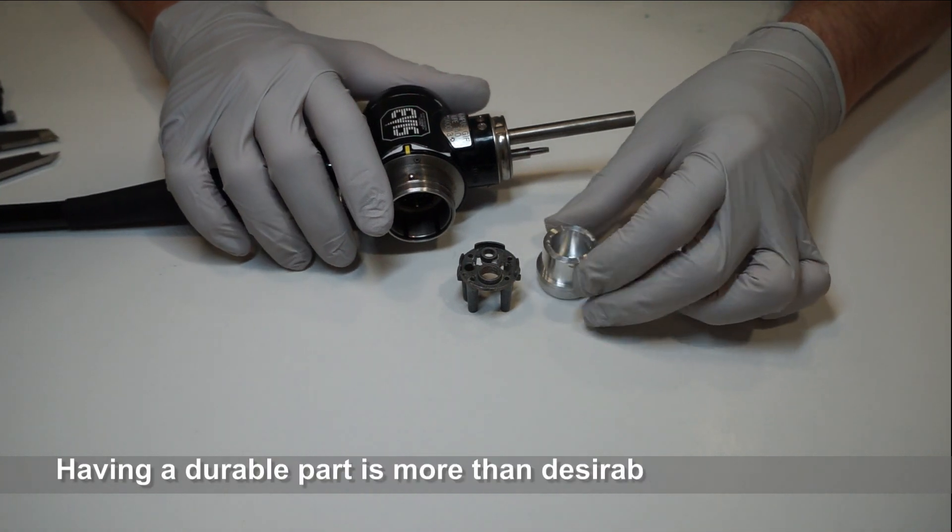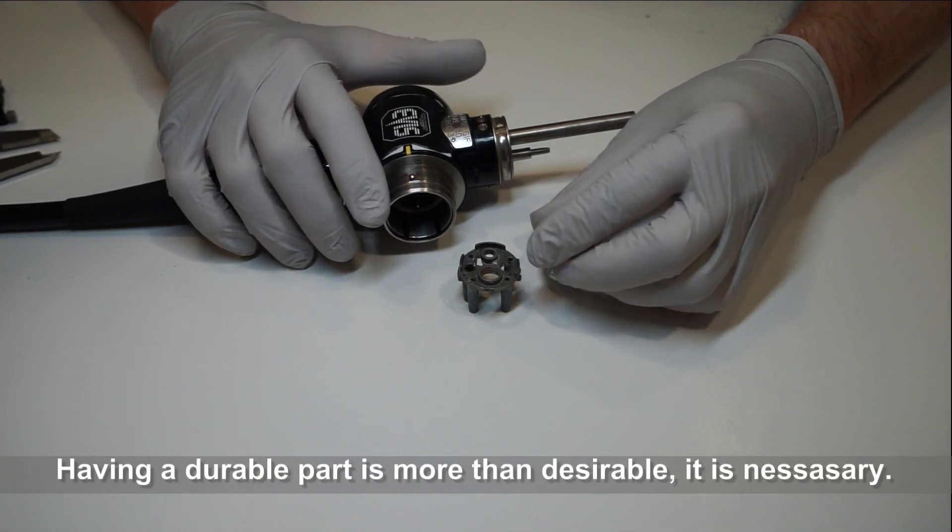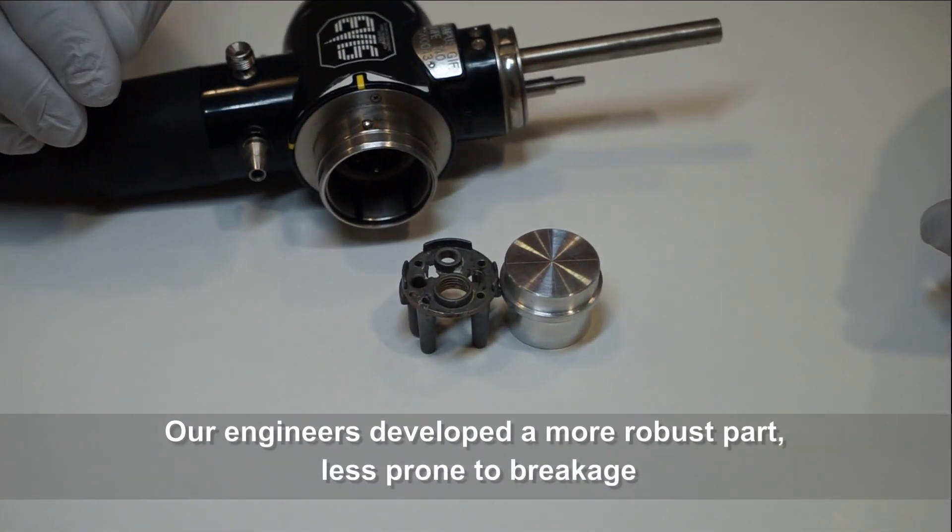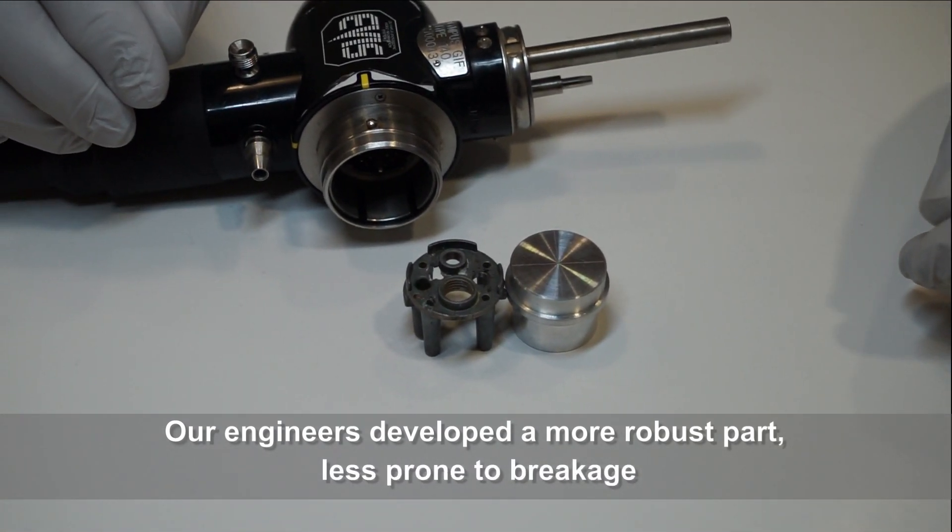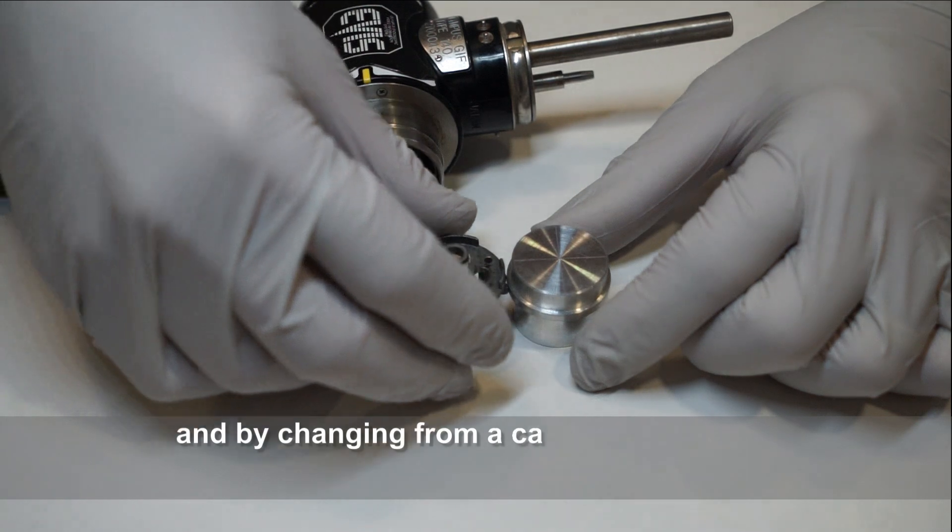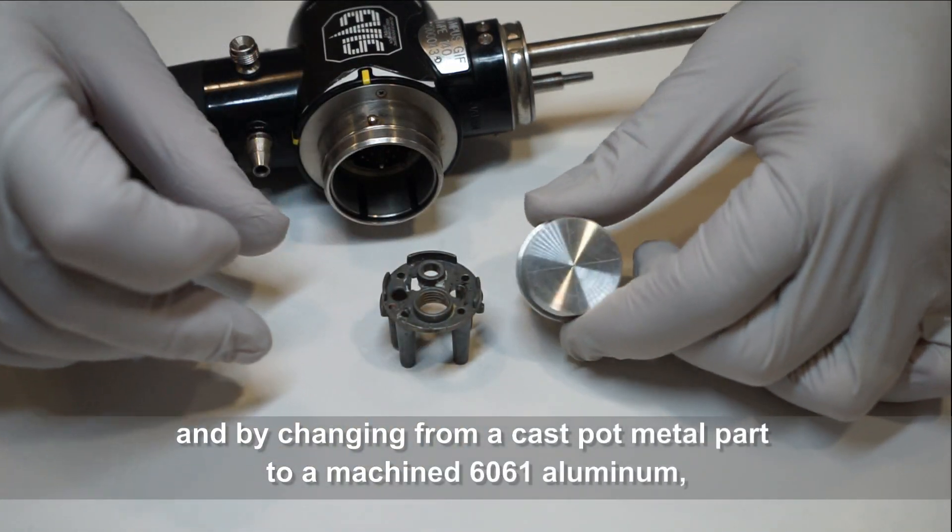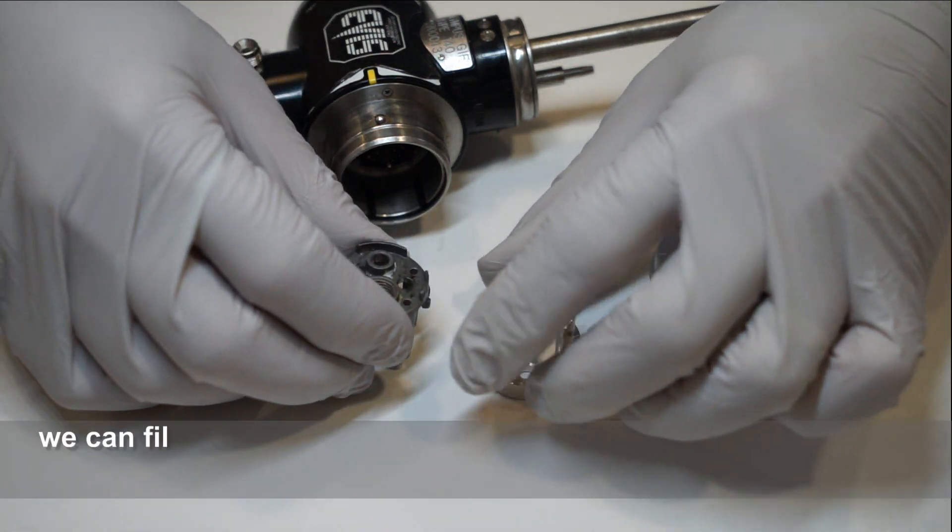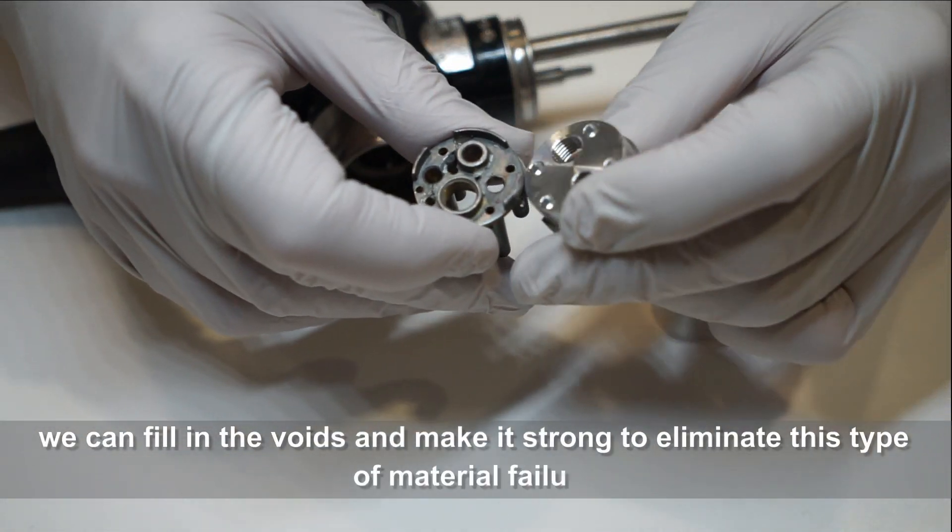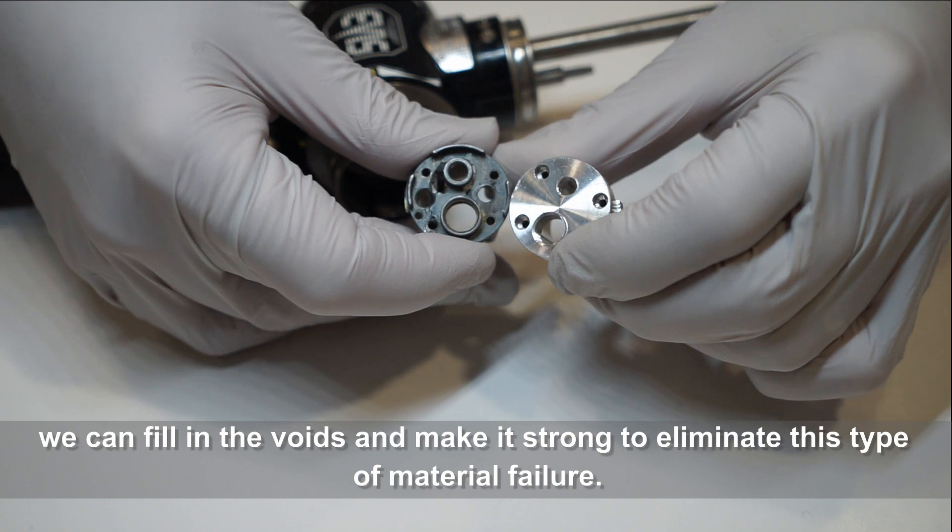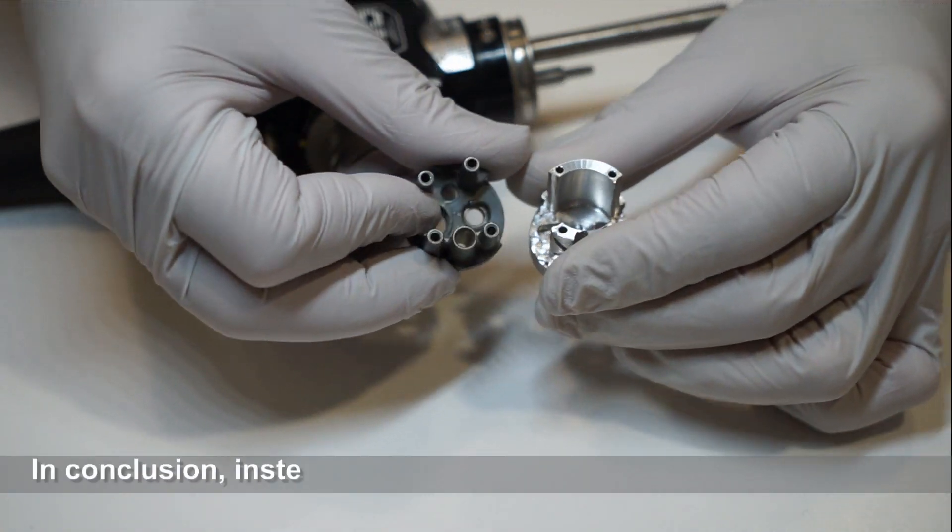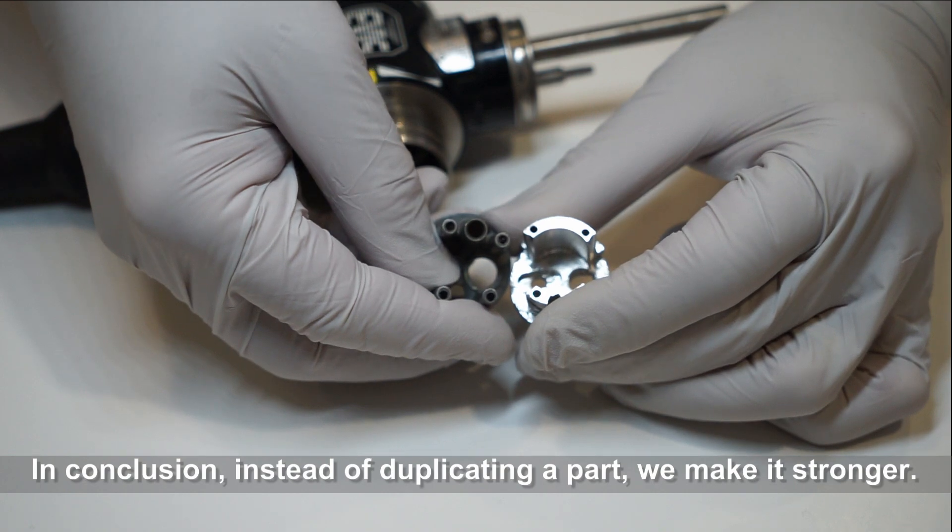Having a durable part is more than desirable. It's necessary. Our engineers developed a more robust part, less prone to breakage. And by changing from a cast pot metal part to a machined 6061 aluminum, we can fill the voids and make it strong to eliminate this type of material failure. In conclusion, instead of duplicating the part, we'll make it stronger.